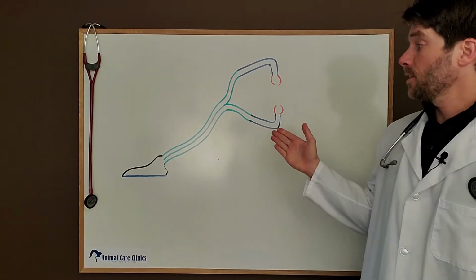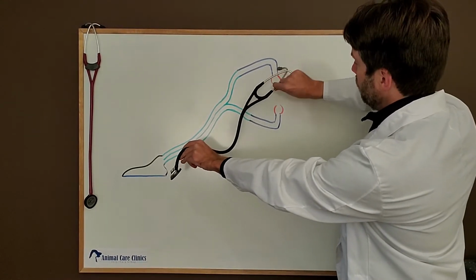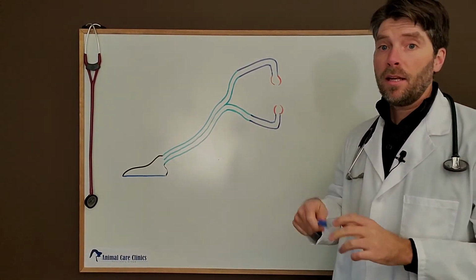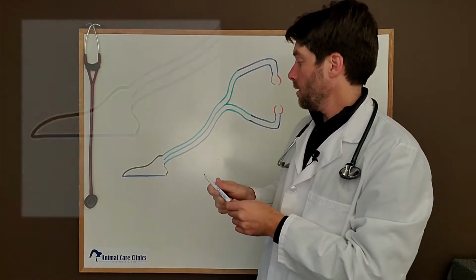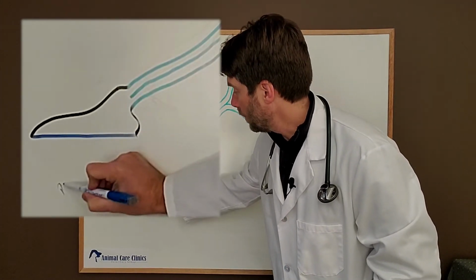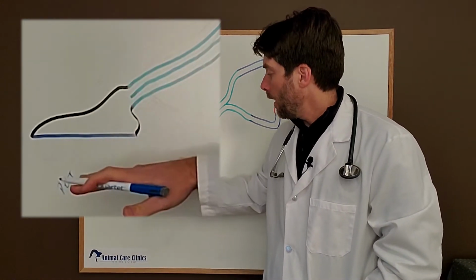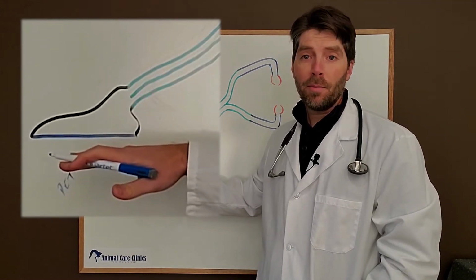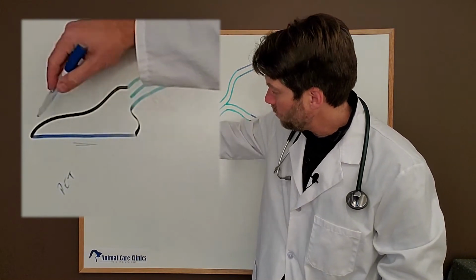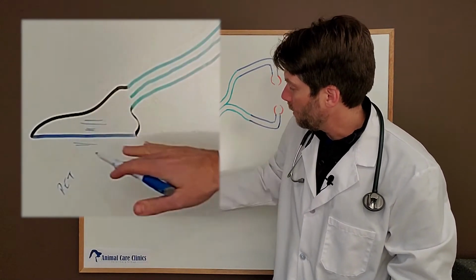I've got a mock-up of a stethoscope on the whiteboard here, and it corresponds pretty closely to my stethoscope. Let's look at how it works. So I've got my handy dandy marker here, and we're going to start off by talking about the diaphragm and drum. So your pet is here, and this is what we place the stethoscope against. Now, the wiggles in the chest of your pet, made by the heart and lungs, come to the surface, and they wiggle the diaphragm here. And those wiggles get transferred up into the drum, and they get amplified by the size of the drum.